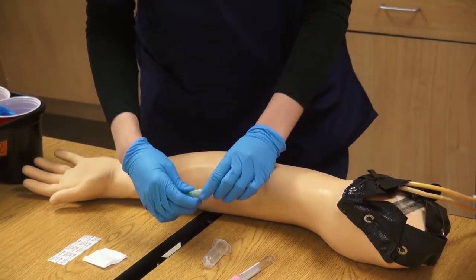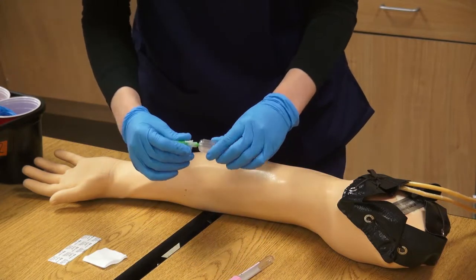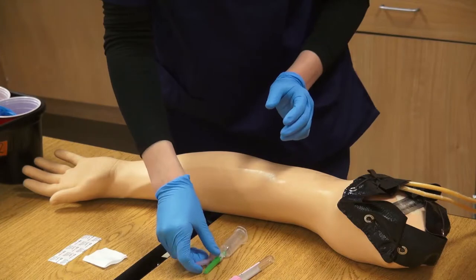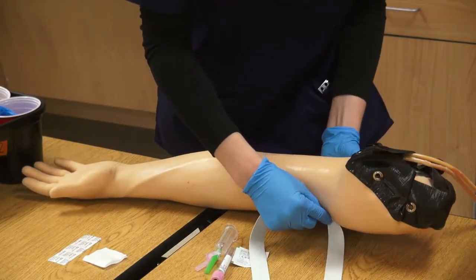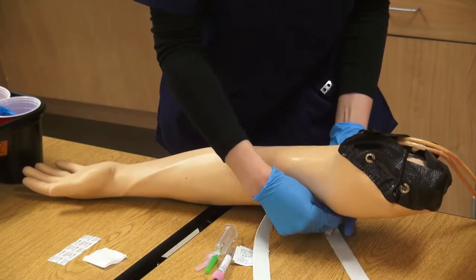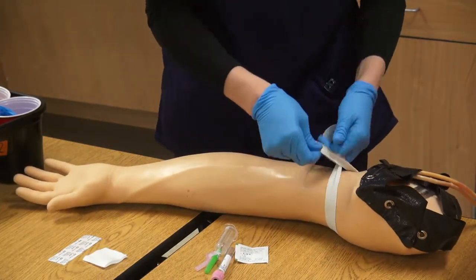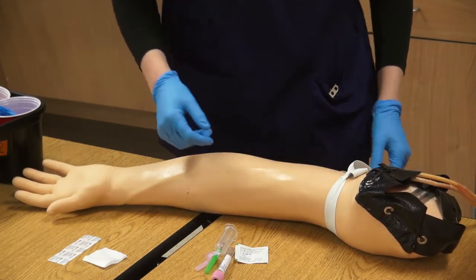Before applying your tourniquet, you will want to connect your needle to your hub and throw away any excess plastic that you remove from your needle. After preparing your needle, apply the tourniquet to your patient's upper arm, leaving one of the tails accessible so that you can readily remove the tourniquet when needed.